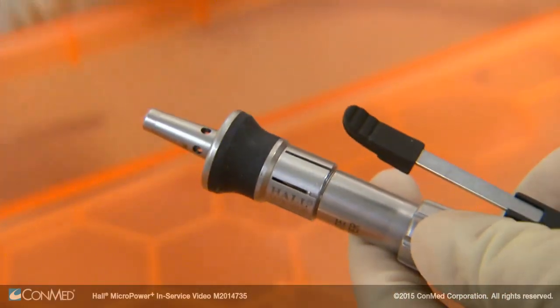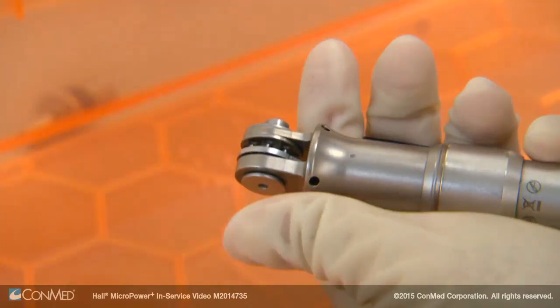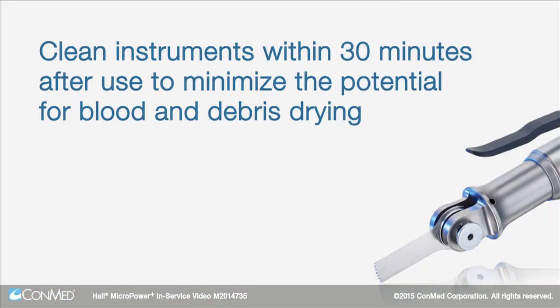First, remove the attachments, electric cord and cutting tools from the handpiece. Clean instruments within 30 minutes after use to minimize the potential for blood and debris drying.